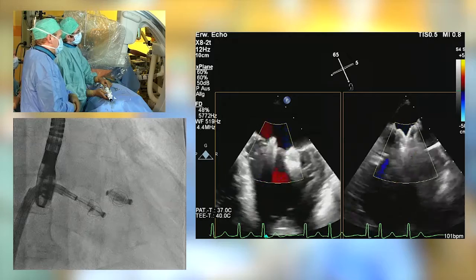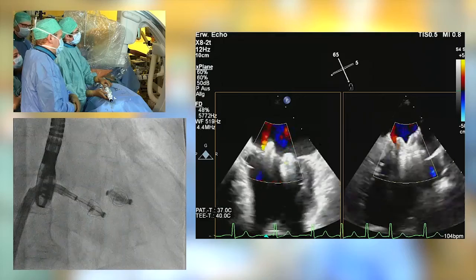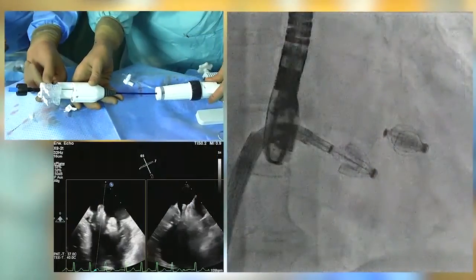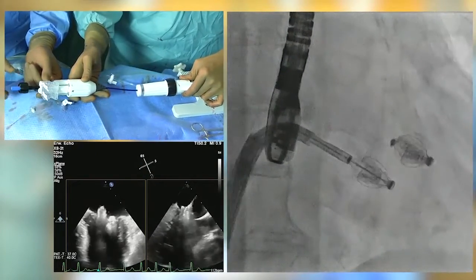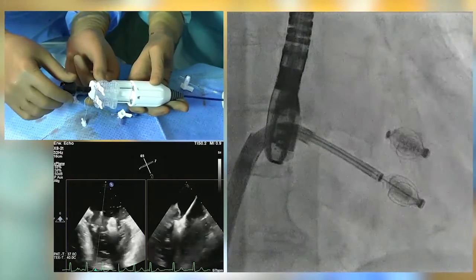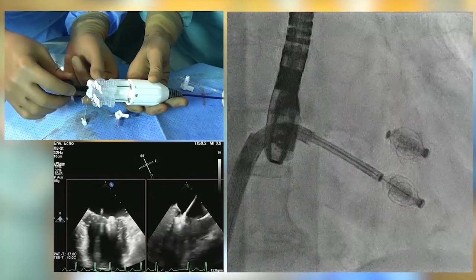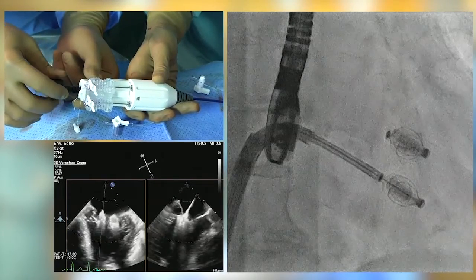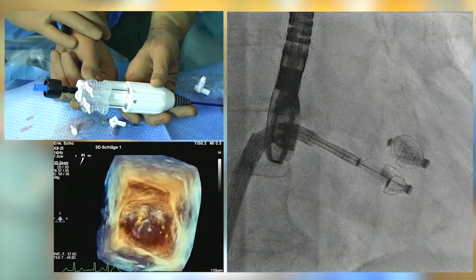Now we are just above this medial MR jet. The device is opened. We are ready to cross in a second. We close the device before we cross it, just to make sure that we don't get entangled into the first device. Obviously, the risk is lower when you cross the valve with the device being closed. We cross the valve, we open the device. We are still in the same position we were aiming for. We move the device already slightly into the leaflets and now opening it, double checking clocking.